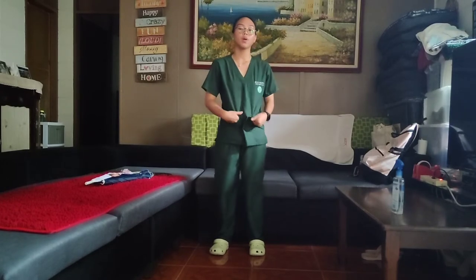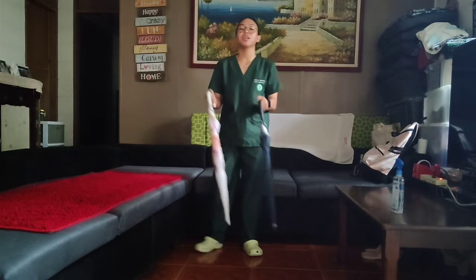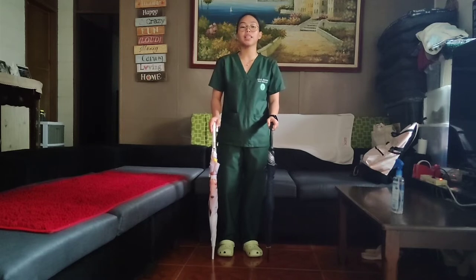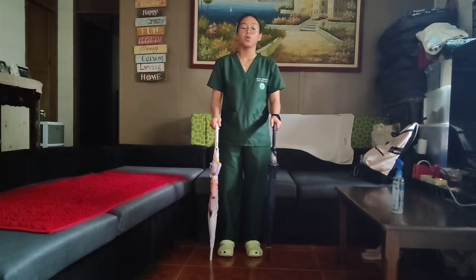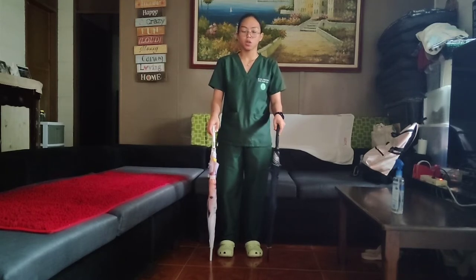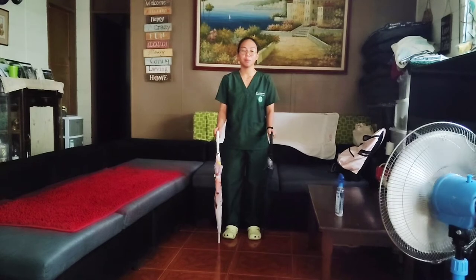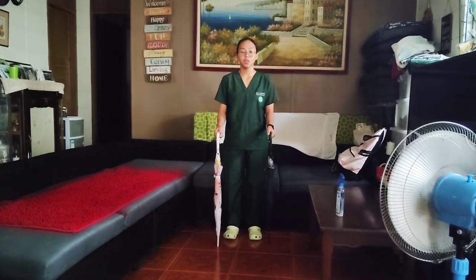The next assistive device we're going to use is crutches. We have improvised crutches, and we will assist our patient to walk using the appropriate gait. The height of the crutches must be fit to the height of the patient.